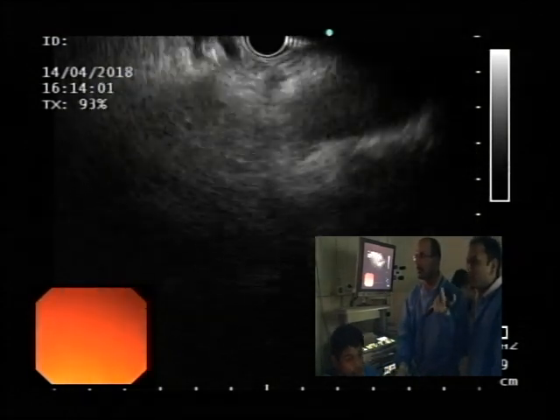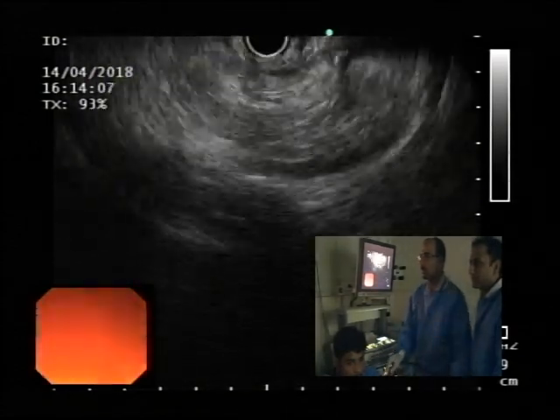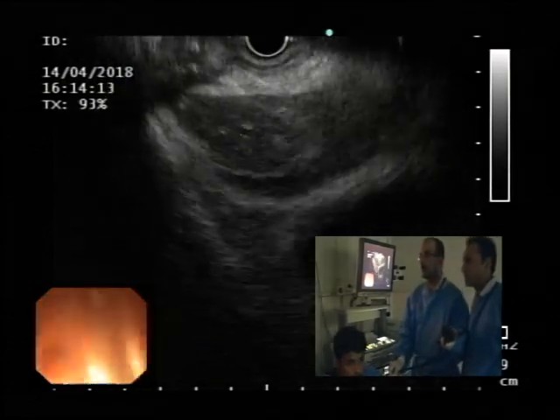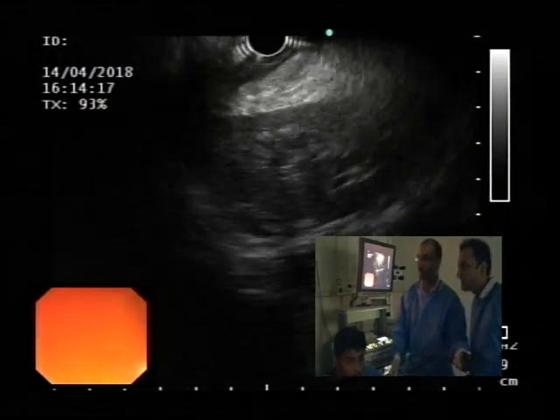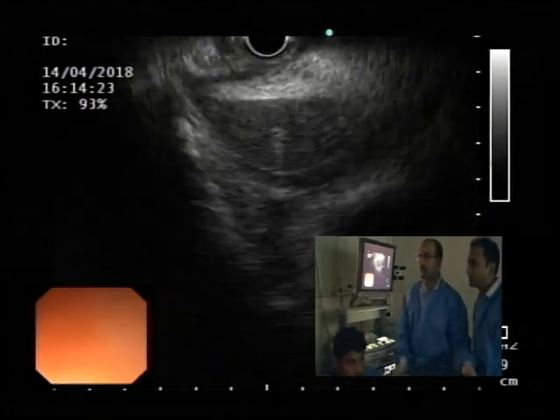Yeah, let me see. That's probably aorta. That is part of your liver and there's ascites behind it. So actually what I'm doing is I pushed in and I'm having to flex down so I'm against this lesser curve, the back wall.